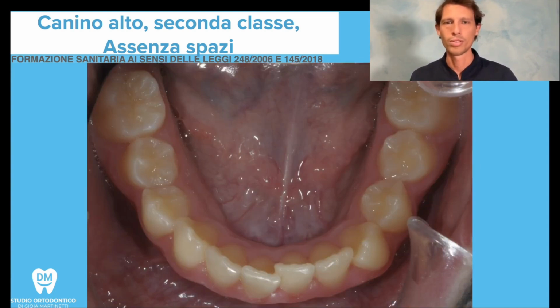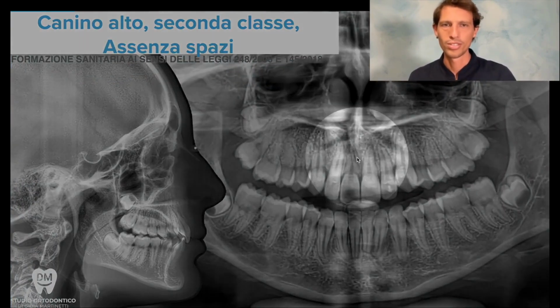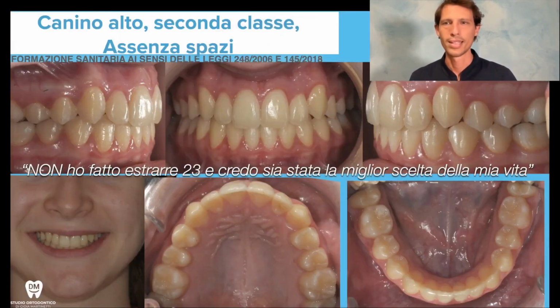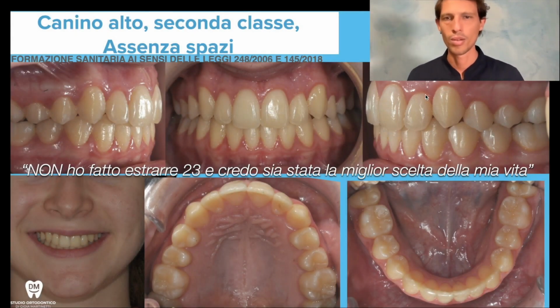We managed to achieve everything we want, and of course in the lower arch as well, we align the teeth properly. The final result is all the teeth straight in the mouth. And this is the beginning. And this is the end of the treatment, and this patient says that indeed, not extracting this canine, which was very high up, some would have even considered extracting it, was the best choice of her life for her smile, for her life. And this is what can be achieved in patients with a class 2 malocclusion, a proper closure with aligners, elastics, and attachments.